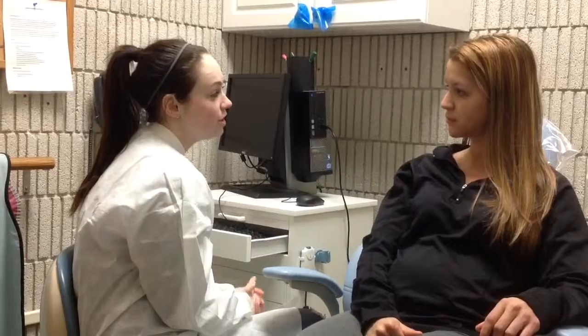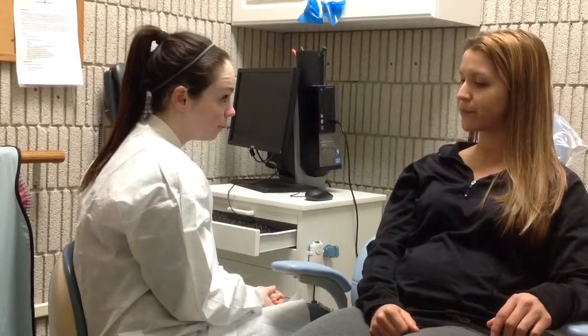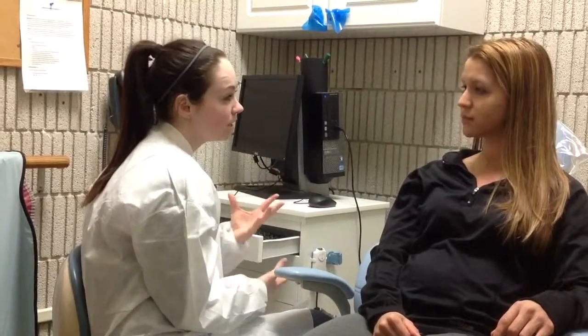Hi Karina, during your assessment I noticed that you had some crowding in your mouth, and I just wanted to take a panoramic x-ray, which is going to show your jaw and the surrounding structures, just so I can see that your adult teeth are going to be erupting properly and that you have enough space for all your teeth.